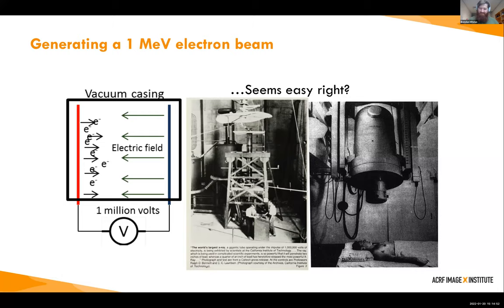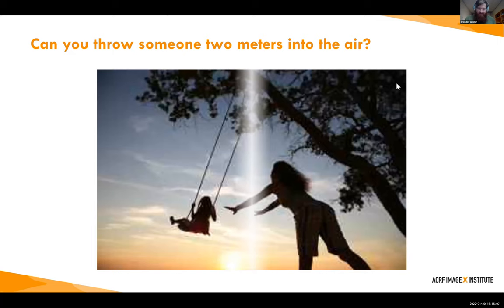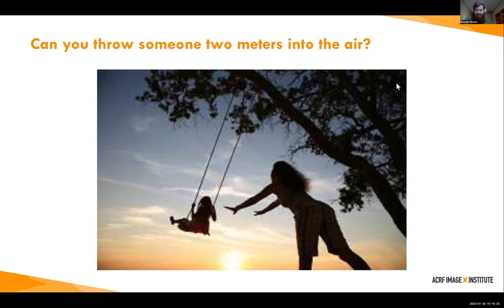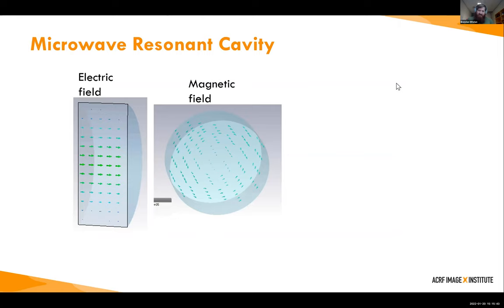The question I like to pose here is: are you capable of throwing someone two meters into the air? For most of you the answer is no, but it's a trick question — you can using something like a swing. Every time you push you put a little bit of energy into the system, the system stores that energy, and over time the person gets more and more energy and goes higher and higher. We can use very similar concepts to accelerate electrons without ever having to produce 1 million volts of electricity.